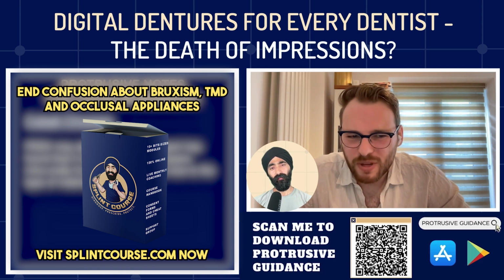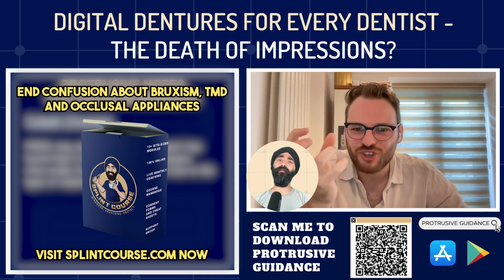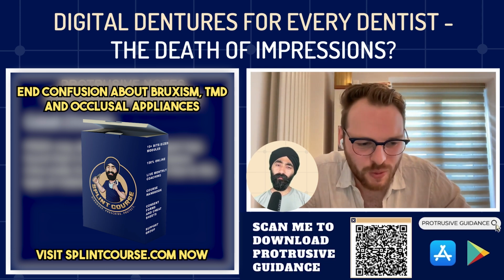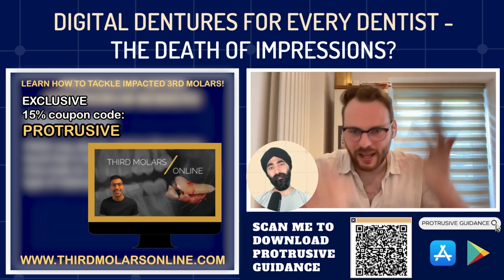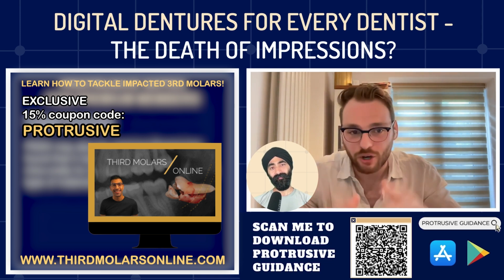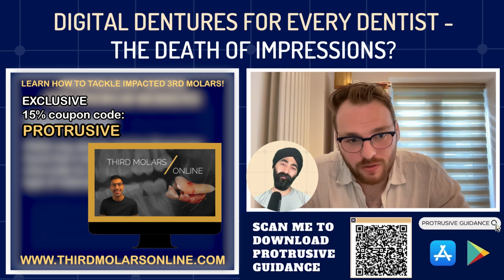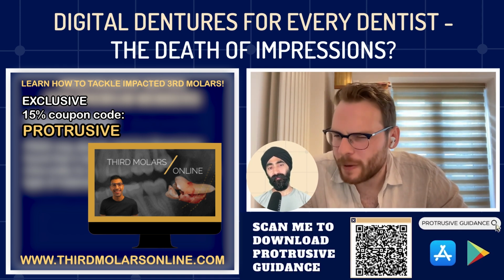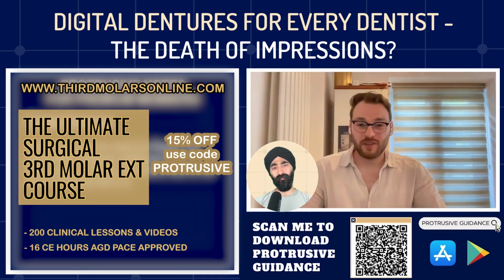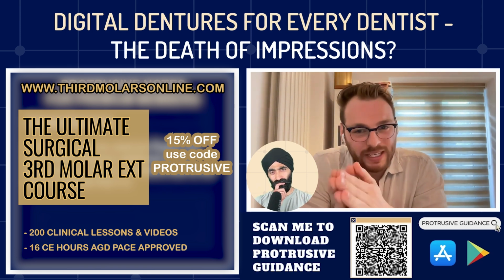Space usually tends to be a problem with PEEK. You need connectors and things to be quite chunky, and it can be quite challenging. We had a case where the patient didn't want metal, but didn't want a full palate acrylic, etc. So we had to do a chrome essentially, but they didn't want metal. We didn't go through with it in the end because there's not enough space. It's metal or nothing, I'm afraid. But PEEK can be done as well. I'm not sure about printing PEEK style materials yet. But the issue for us is that at the moment, we don't feel it's better yet.